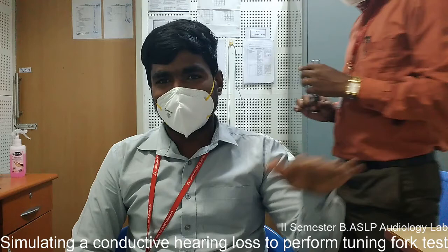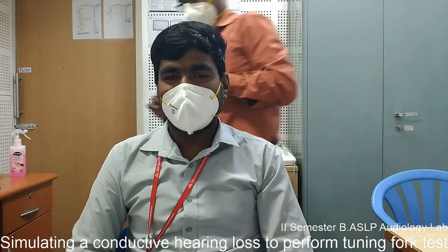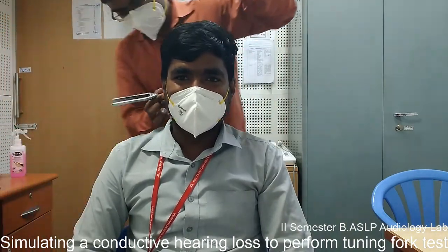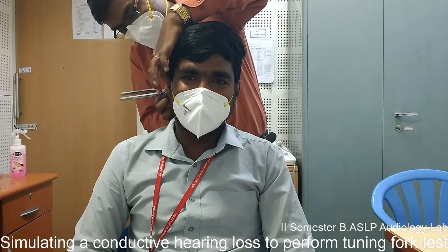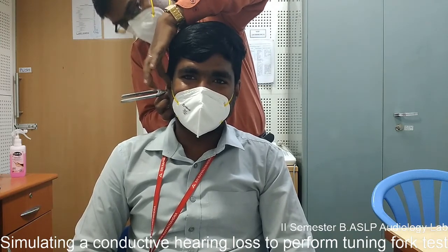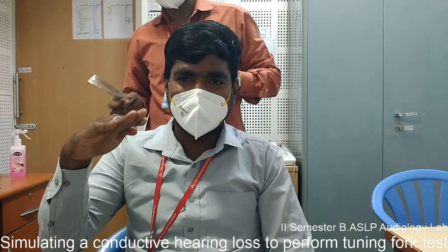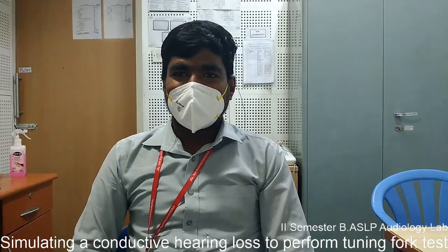This indicates Bing negative. Bing negative denotes that the side has conductive hearing loss. Now let us see the Bing test result on the unoccluded side. We are alternatively occluding and unoccluding the ear canal, and the subject is able to perceive fluctuations in the loudness through bone conduction.